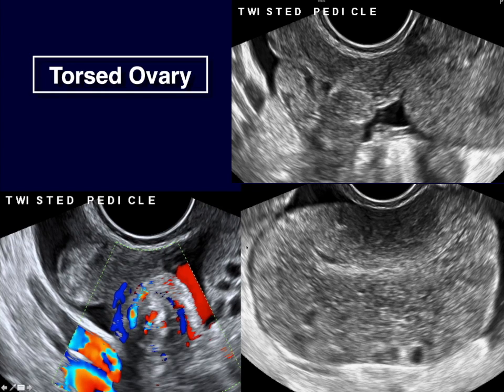Now, here's the key: if you turn on the color, you will find the whirlpool sign, which is a very reliable sign of torsion of this ovary. Now, you can have color in the ovary or not. That doesn't seem to have really an impact on whether or not this is torsed, so you can have a torsed ovary that has color flow.